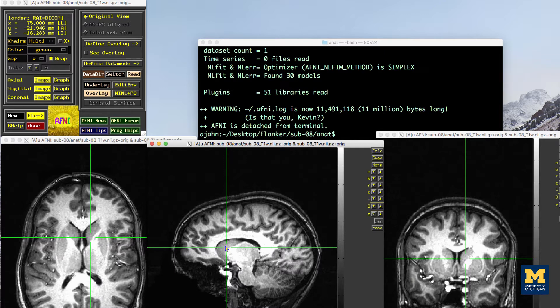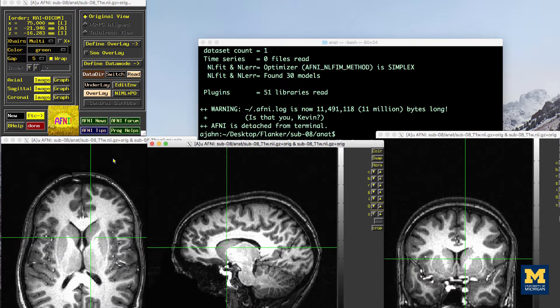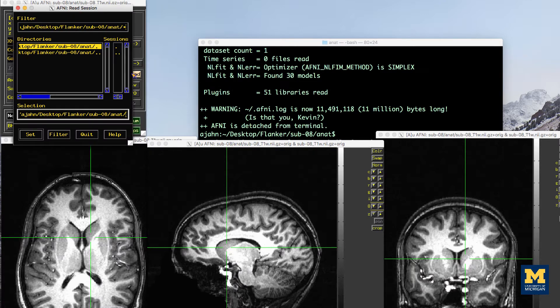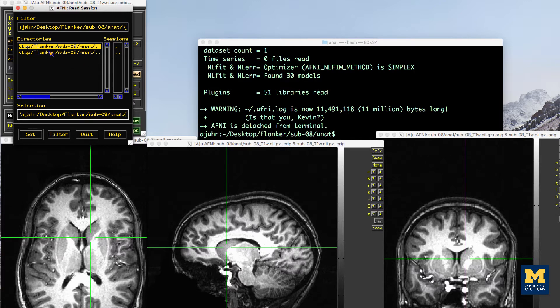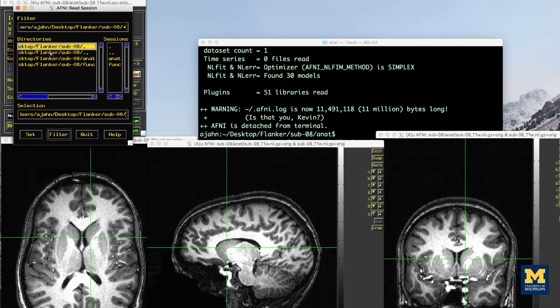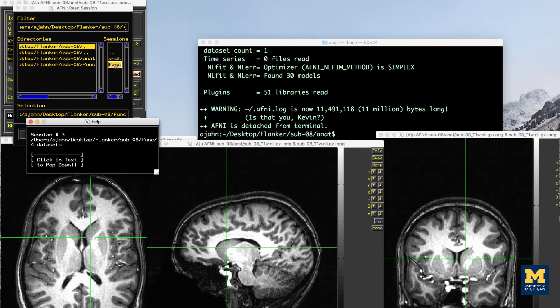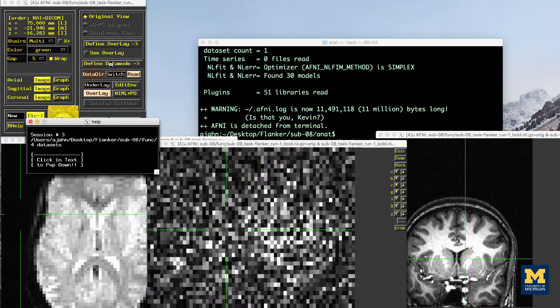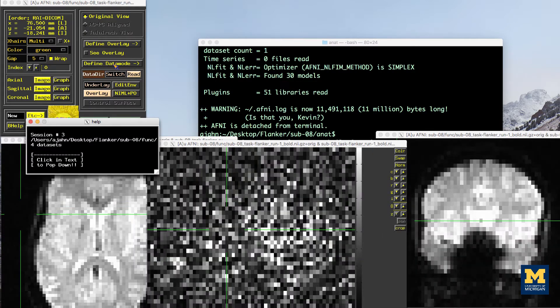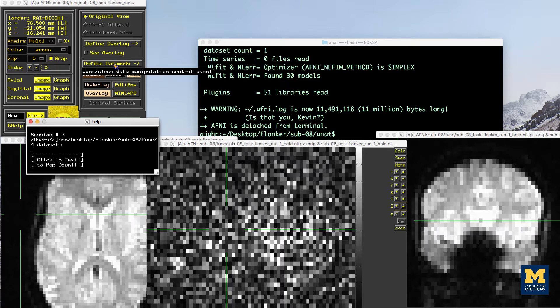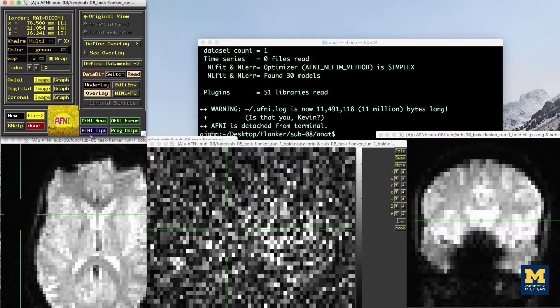When you are done looking at the anatomical image, you can load in other images while staying in the same directory. Click on the Read button from the menu at the top of your screen, and then in the Directory sidebar, double-click on the file path that ends in two dots, which indicates the directory above the current directory. Then double-click on the FUNC directory in the session's sidebar. This loads all of the images in the FUNC directory, which you can then browse in the AFNI viewer.